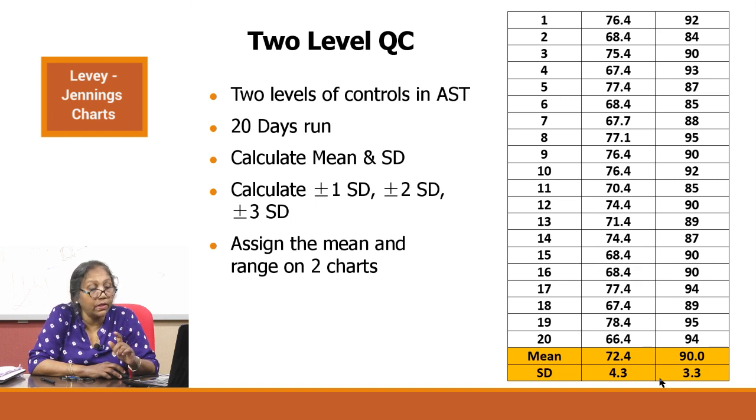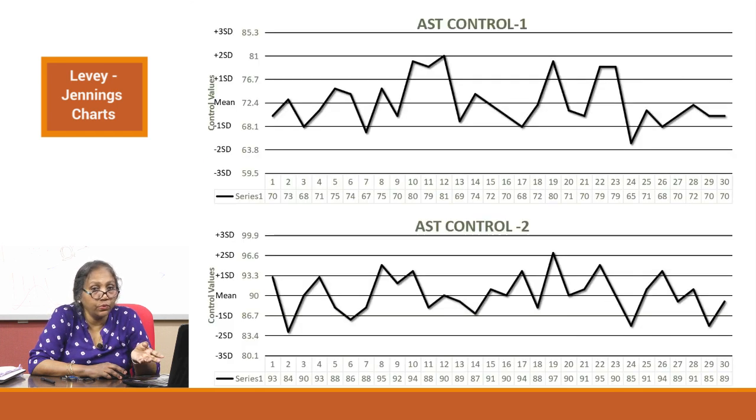After making your calculations, you make a graph. The graph that we talked about will start only when you have your numbers ready to start. And once you start, you plot it daily, and then you monitor it daily and periodically, both are required, and that is how you do your QC program. These are the basics about doing LJ monitoring.